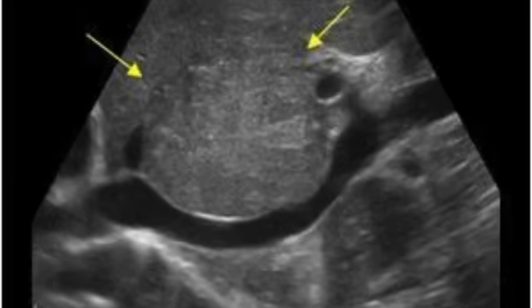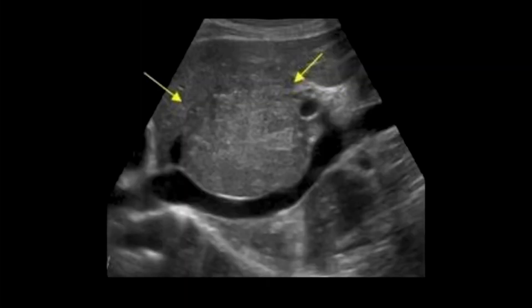Hey there, sono-peeps, Henry here. So here we have a sagittal image of the liver showing an isoechoic lesion or mass. This mass is located anterior to the IVC. On top of being isoechoic, it is also slightly heterogeneous, especially when compared to the rest of the liver echotexture.